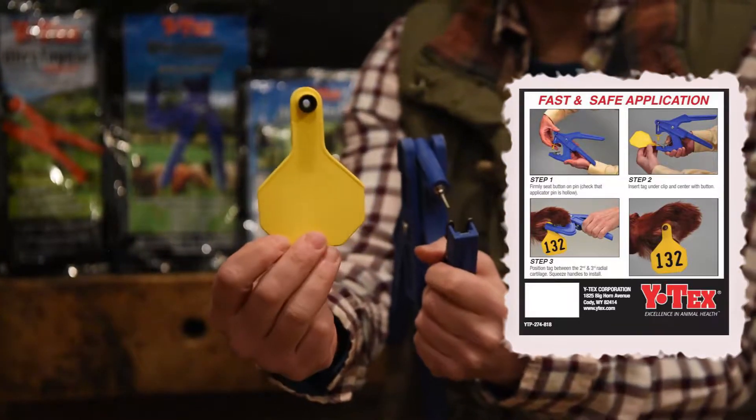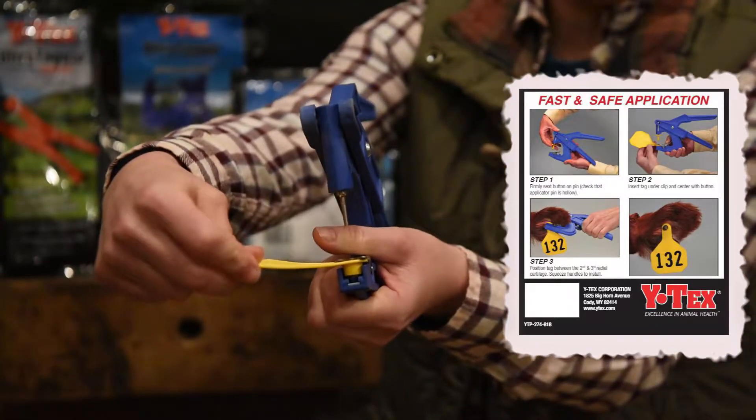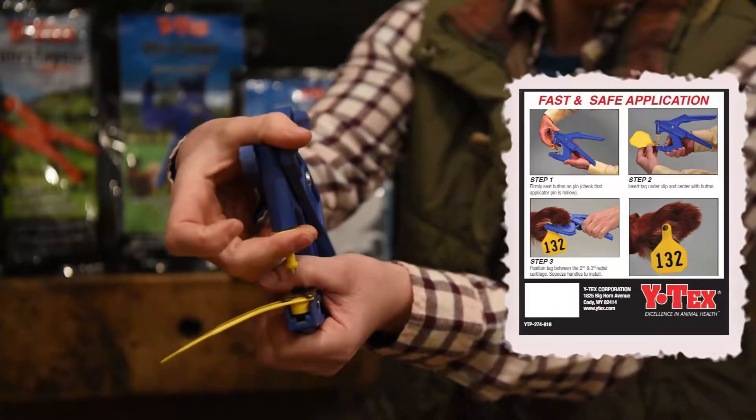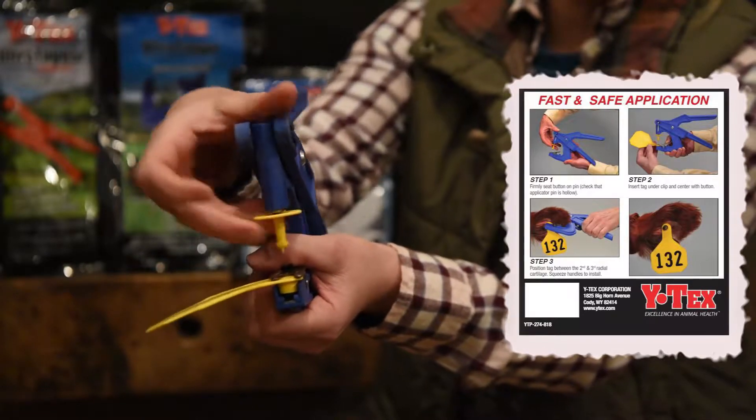The 3-star tag goes face down into the tagger. Your button loads onto the pin. You will hear it pop onto the pin when it's securely latched.